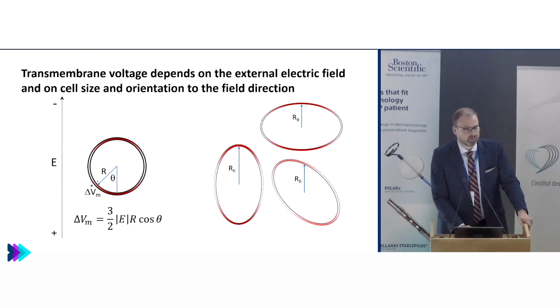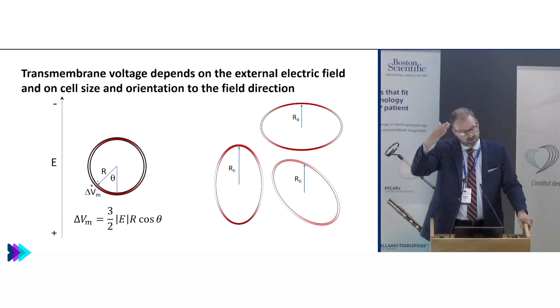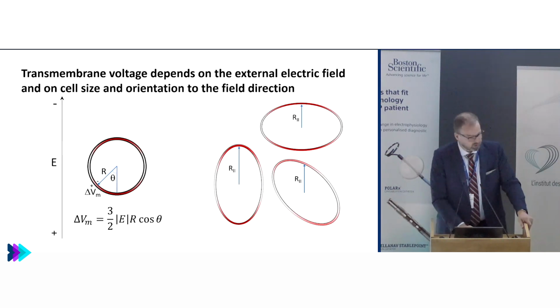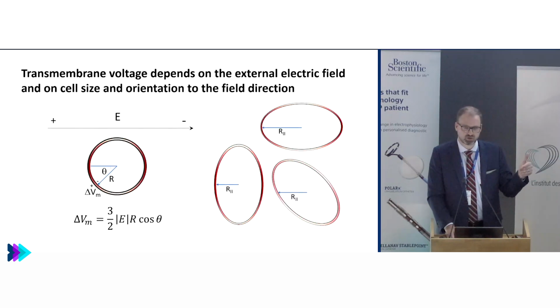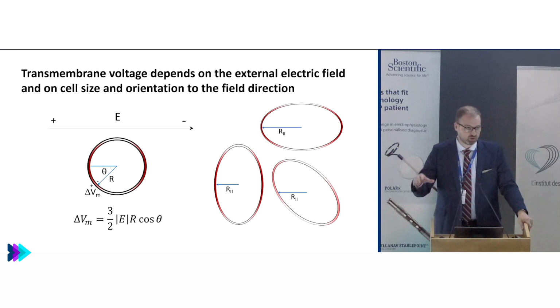So that's fine. Maybe we don't need that. We can electroporate. If you're looking at myofibrils wrapping around the PVs, they're all going to be affected differently by the local electric field, depending on the direction in which they're exposed to it. Certain edges will get more poration than other edges, and more variety. That's what I'm showing here with this red coloring: you will have a heterogeneity in the field. So one thing that would certainly be useful, especially if you're designing a system and a catheter together, is to change the direction of the electric field. Changing the direction of the electric field locally will expose those cell membranes to a more circumferential or spatial coverage of poration or permeabilization.